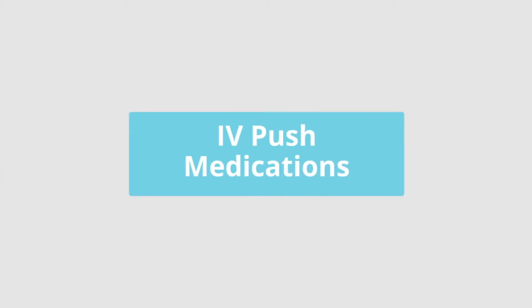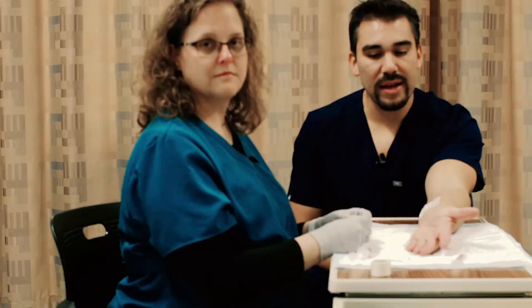Now for IV push medications. Kat here just started an IV on me and now we're going to be talking about the steps of what it takes to give IV push medication.